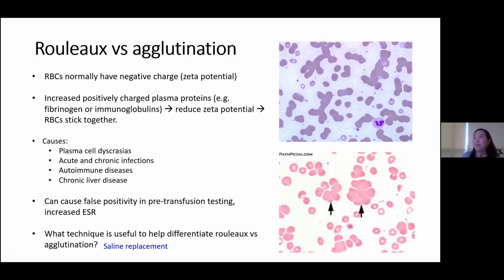Just whilst we wait for some of the information to come through, we've got an extreme case of myeloma here in the peripheral blood, but it's about making sure that the patient is safe as well. If you see these kinds of features with such significant rouleau, look at the renal function and the calcium, because the threat to the patient of cord compression or renal failure is quite high.